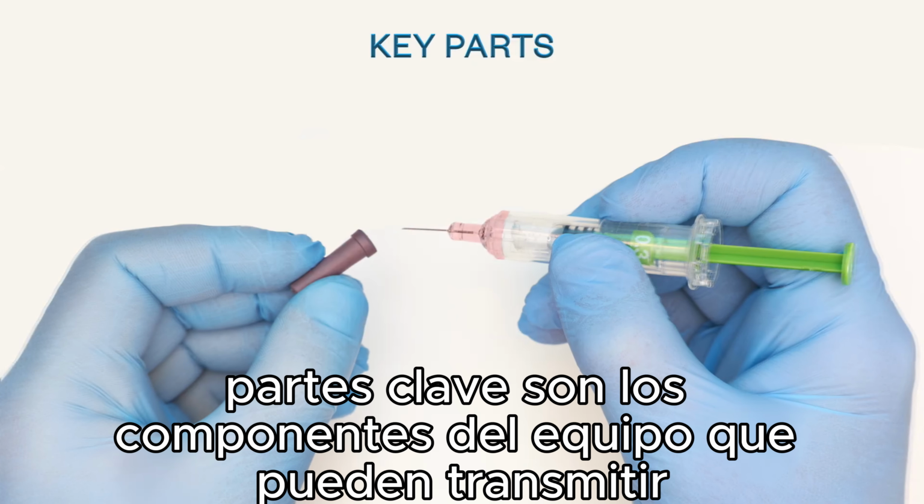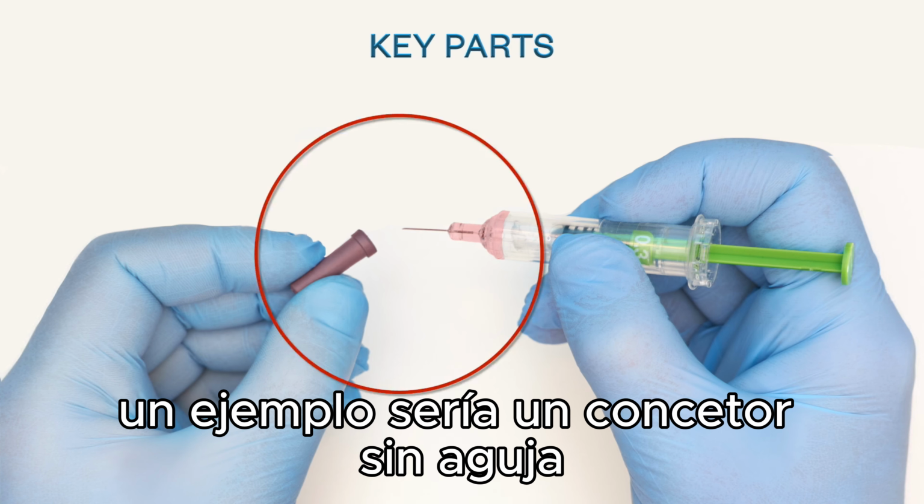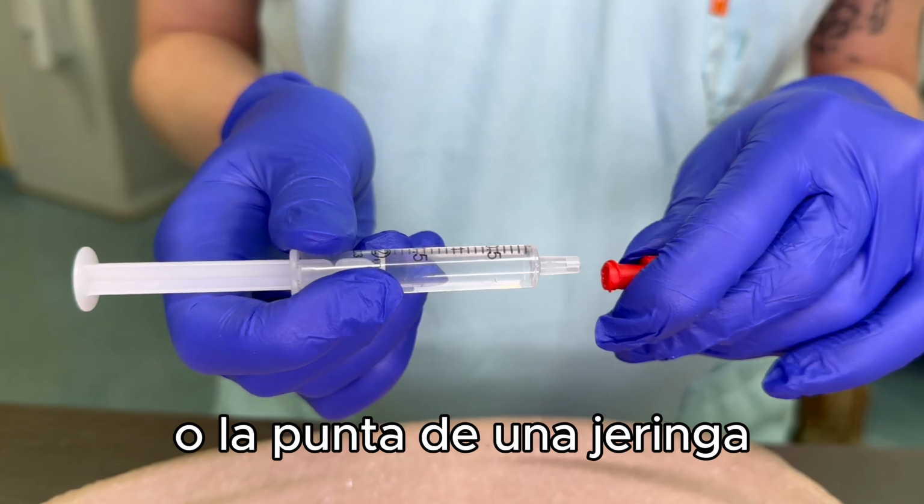Key parts are components of equipment that can transmit contamination to the patient. An example would be a needleless connector or the tip of a syringe.